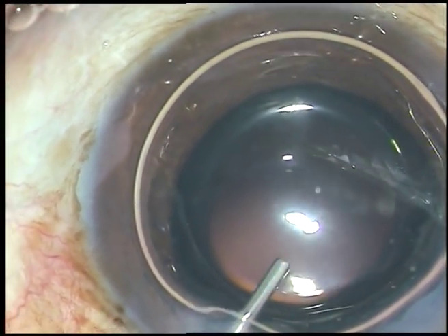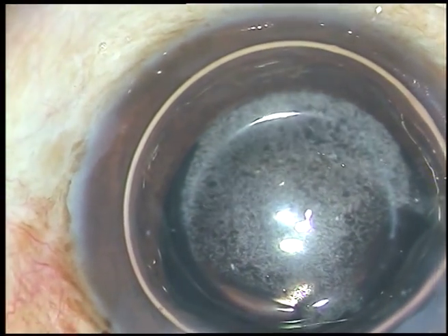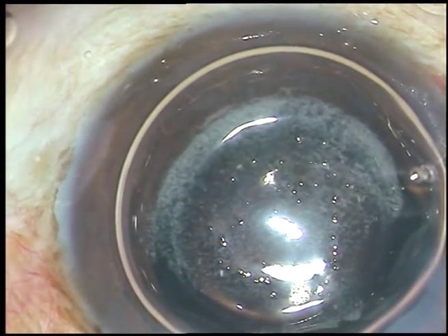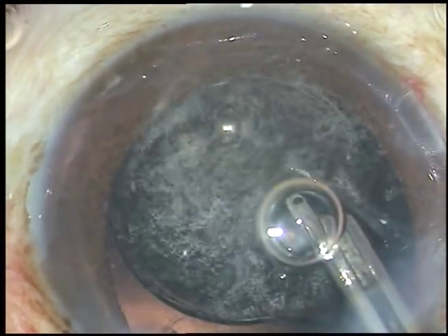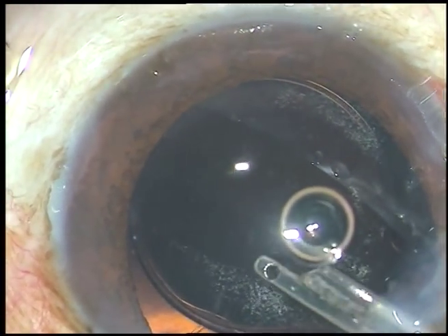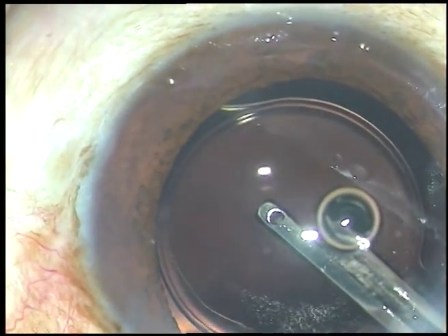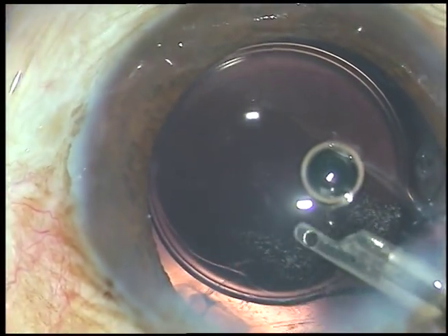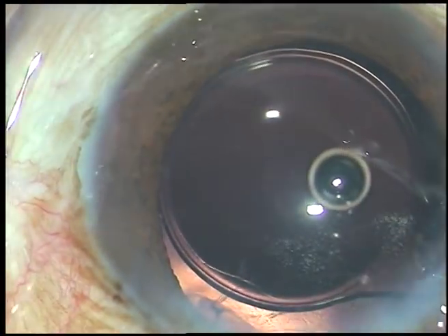Now I am using triamcinolone acetonide to delineate the vitreous strands. I wash out part of this triamcinolone acetonide with a 23-gauge Simcoe cannula. I can then see that the vitreous is present just in front of the main incision and at 12 o'clock and 2 o'clock.